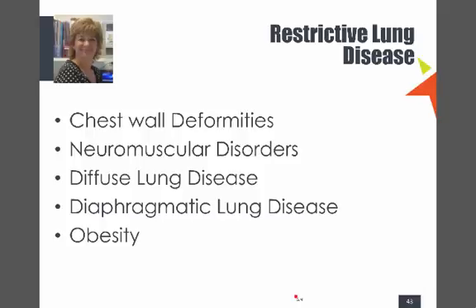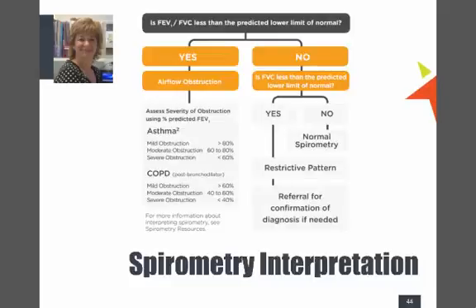So you can't make a diagnosis. And I have seen this. Someone did a spirometry on someone who was about to give birth, just going into labour, and gave her a diagnosis and wanted to follow her up for a restrictive lung disease. The poor woman was pregnant. She couldn't get her air in. As soon as it was redone after she'd given birth, and she was back to normal, funnily enough, with her hair pulling out, but she was normal.